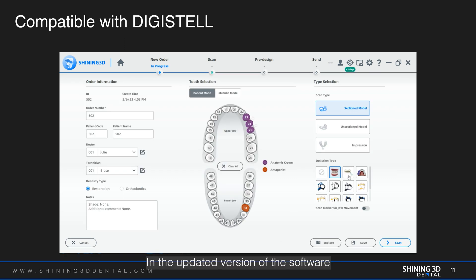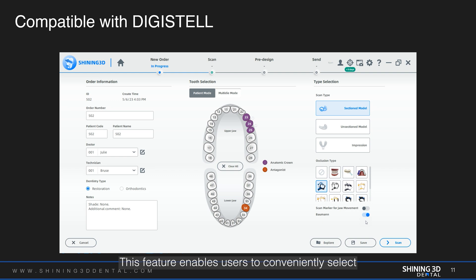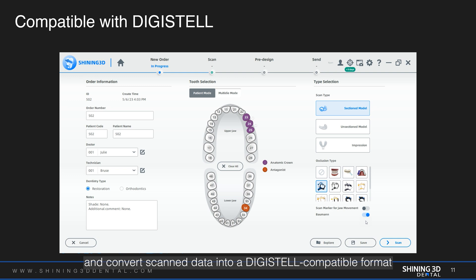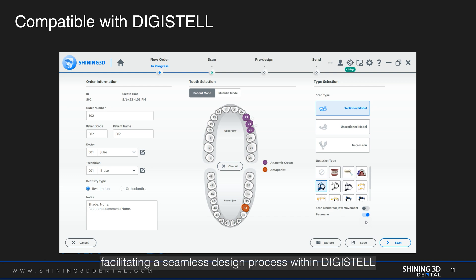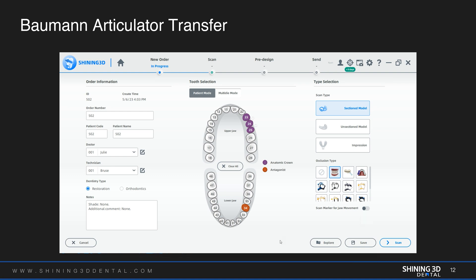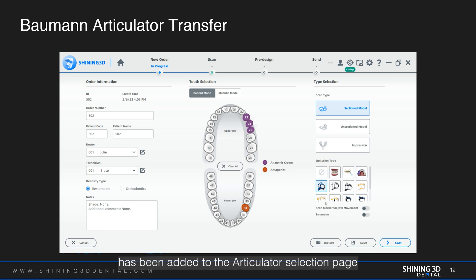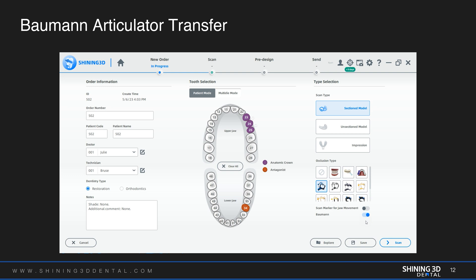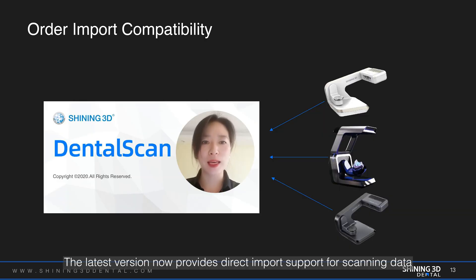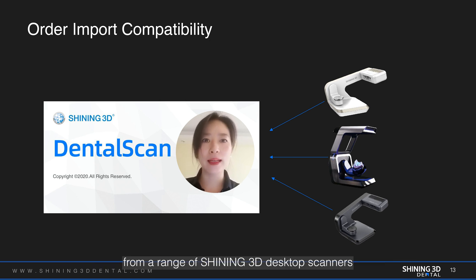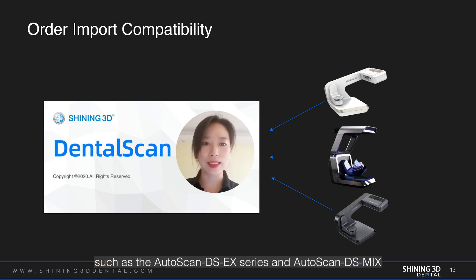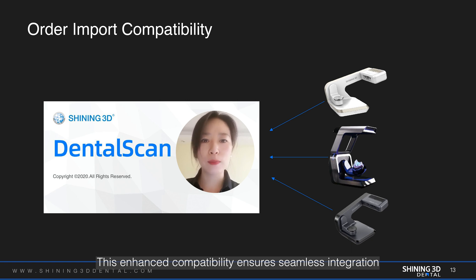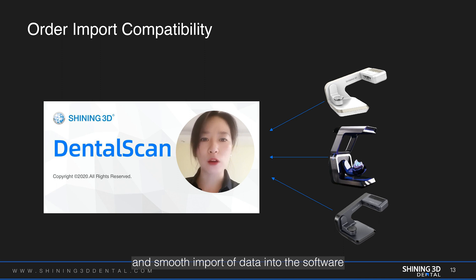In the updated version of the software, users can now export data in a compatible format for DigiStyle software. This feature enables users to conveniently select and convert scanned data into a DigiStyle compatible format using the export options, facilitating a seamless design process. Additionally, a Bowman articulator transfer option has been added to the articulator selection page. The latest version now provides direct input support for scanning data from a range of Shining3D desktop scanners such as the Autoscan DS-EX series and Autoscan DS-MIX, ensuring seamless integration and smooth import of data into the software.